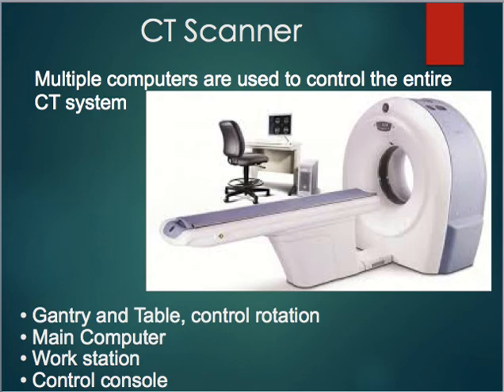So the CT scanners actually use multiple computers to control the entire system. This is usually behind a lead wall. This is not in the same room. It's just kind of showing it together in one picture. But the CT technologist who's scanning is separated because this is radiation. It's emitting radiation, so we don't want to be in the room when the patient's being scanned.